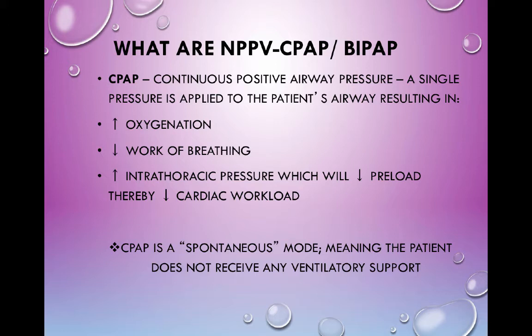So what does CPAP do? Remember what we said with PEEP, same thing. We're going to increase the partial pressure of the gas in the lung, so it's going to increase that diffusion through the alveoli, the membrane. It's going to open up all those airways. It's going to decrease the work of breathing because we've opened up those airways. And it's going to decrease cardiac workload in some cases.